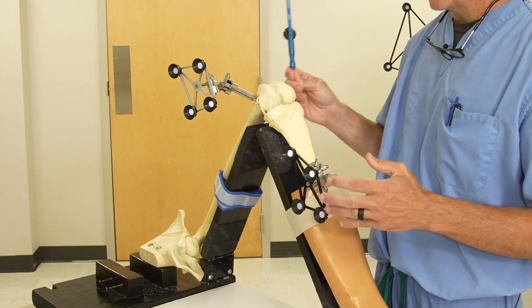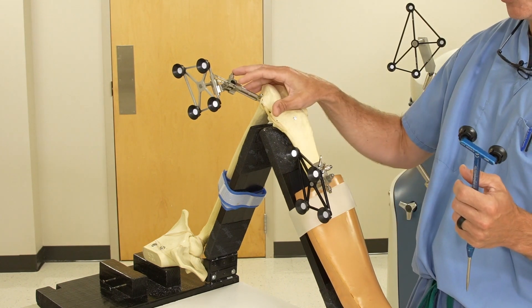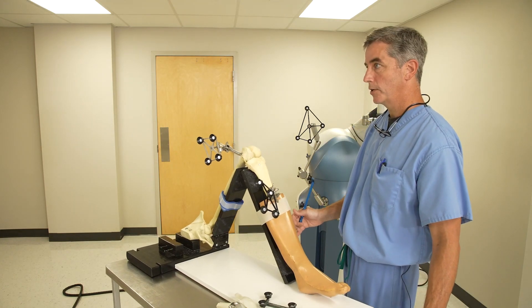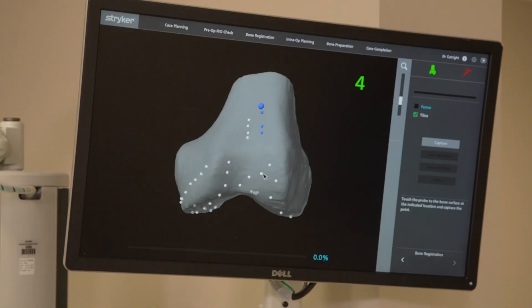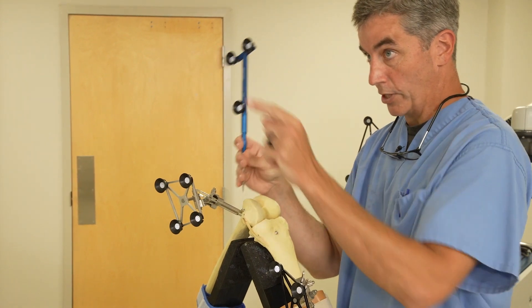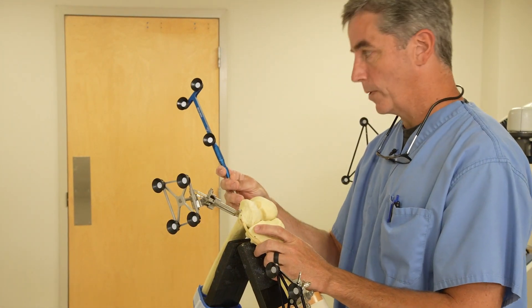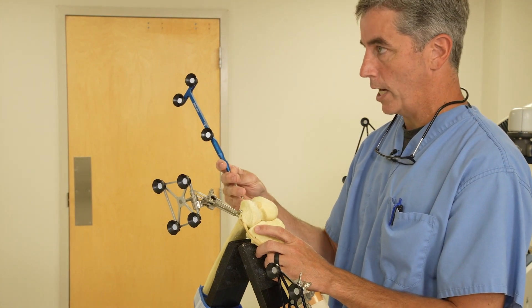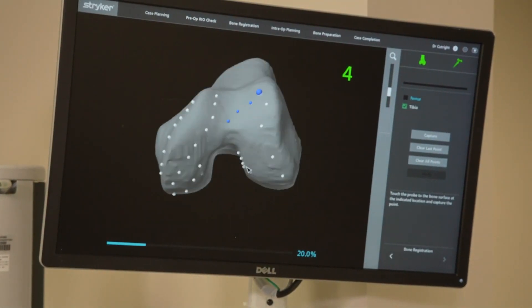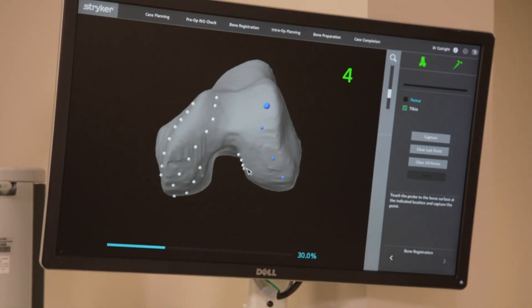So once we have the knee exposed, the next thing we have to do — even though these are attached — we have not yet told the computer where this is. So we have to go through a regimen of telling it where it is. If you look at this screen here, you can see there's a bunch of dots. What we're going to do is use this pencil device in my hand and follow those dots on the screen, touching the top of the bone and following a set parameter.